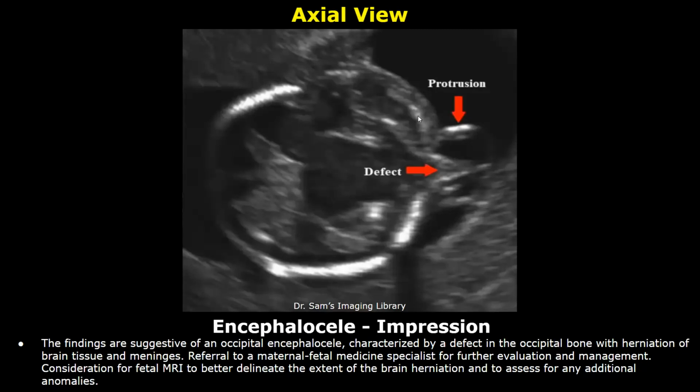Referral to a maternal fetal medicine specialist for further evaluation and management. Consideration for fetal MRI to better delineate the extent of the brain herniation and to assess for any additional anomalies.